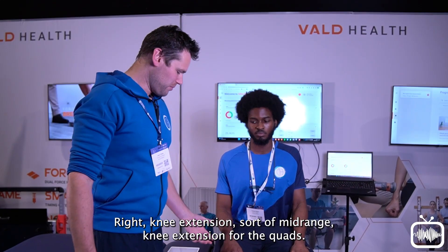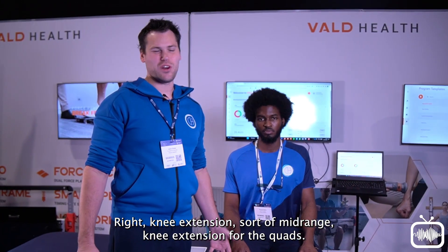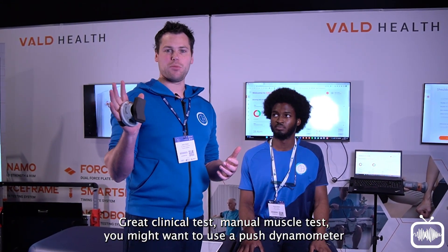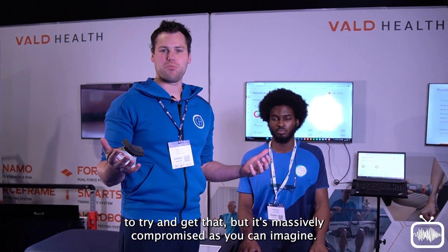Knee extension — mid-range knee extension for the quads. Great clinical test, manual muscle test. You might want to use a push dynamometer to try and get that, but it's massively compromised as you can imagine.